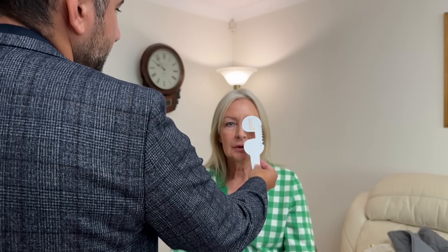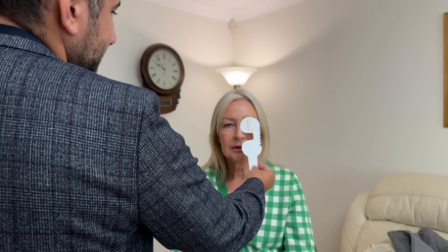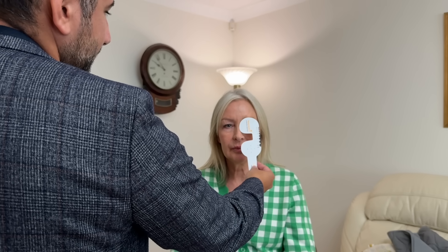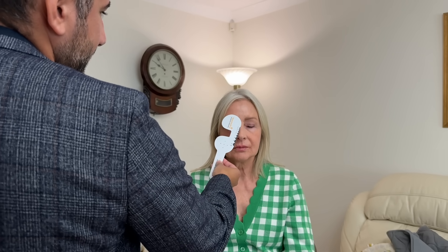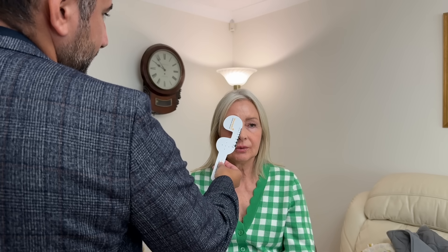Let's do a quick vision check, so looking at the letter chart, both eyes open, blink normally, try the smallest row. C-L-G-H-N-A. And with the left: E-C-T-N-O. Got just slightly worse on the left there.